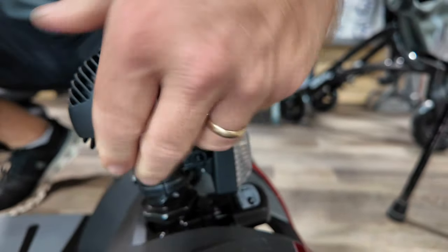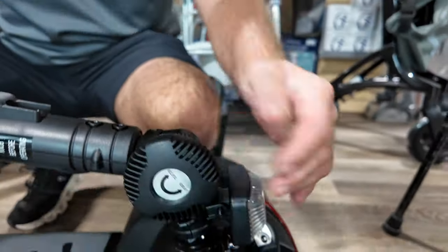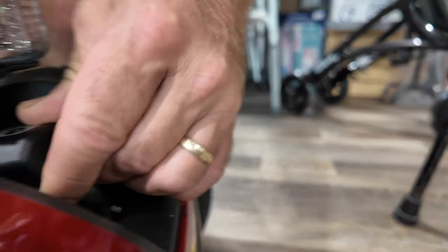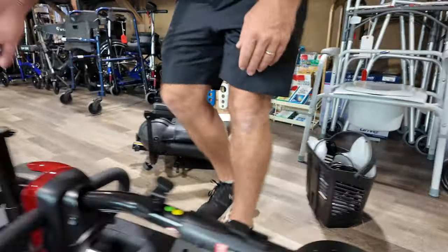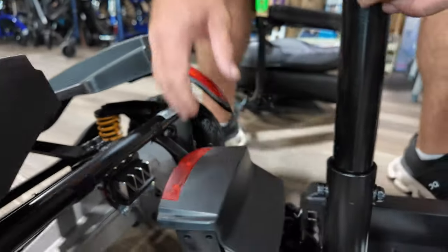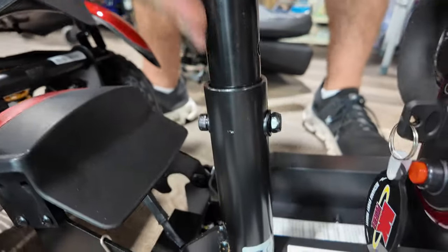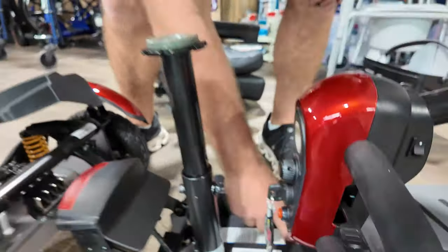If you're going to lower the tiller, loosen this enough to where you're not grinding, then bring it right down. Once you get it here, lock it — this will move on you, so push and turn to keep it from moving. Back here is where you can release the front from the back. You can also adjust seat height. Golden has diagnostics — flash codes and beep codes — so if it gives you a fault code, it tells you what it is.